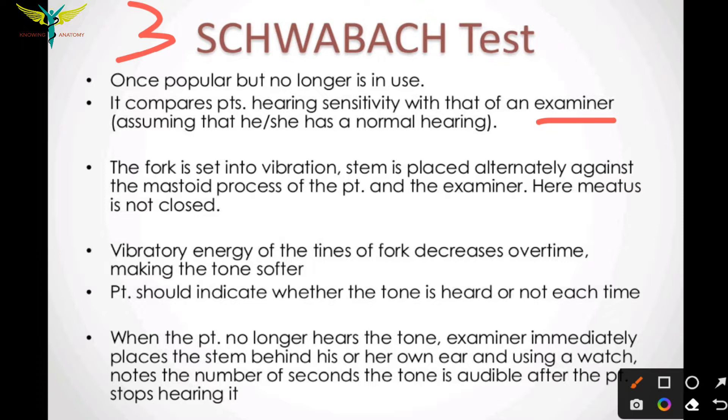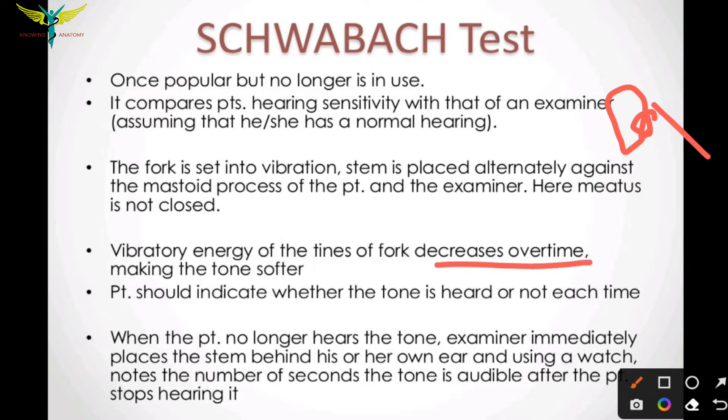The tuning fork is set into vibration and the stem of the fork is placed alternately against the mastoid process of the patient and the examiner. The ear meatus is not closed. The vibratory energy of the tuning fork decreases over time, making the tone softer. The patient should indicate whether the tone is heard or not.